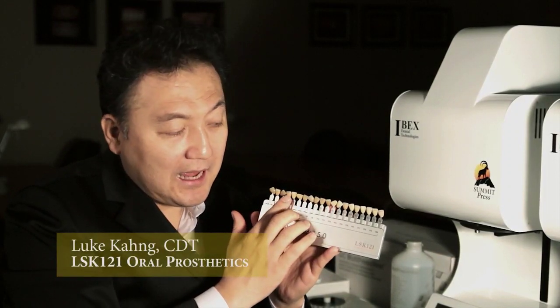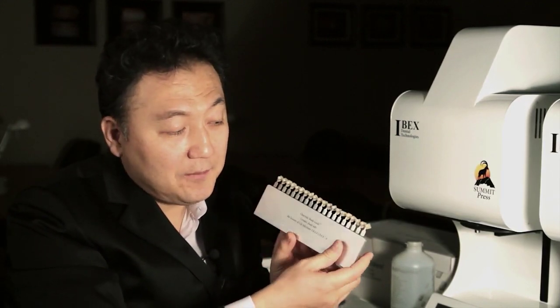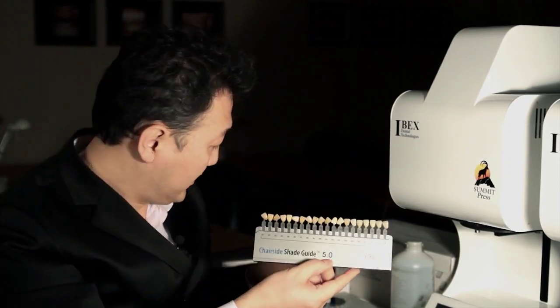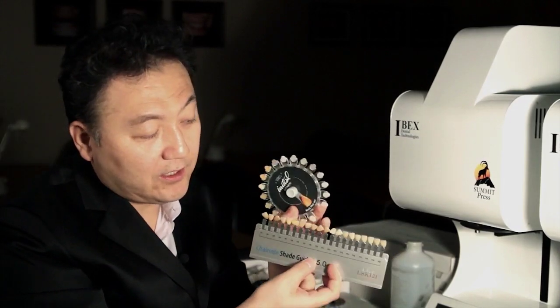Chairside shade guide is unique. This is not acrylic. This is not denture teeth. This is porcelain teeth. So basically I made a press with a GC pressable ingot, and then we press it 50%. And then after that we layer with GC porcelain, all different layering colors.